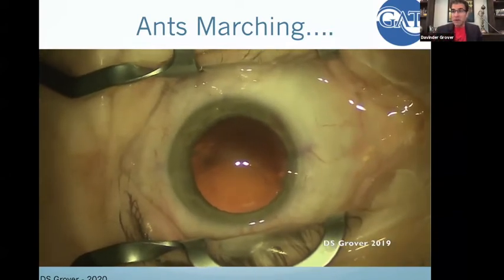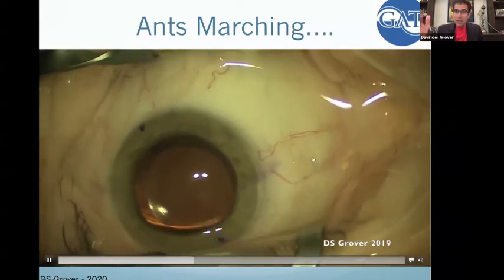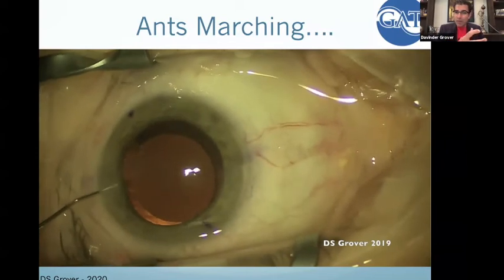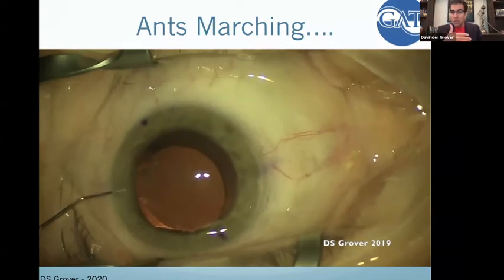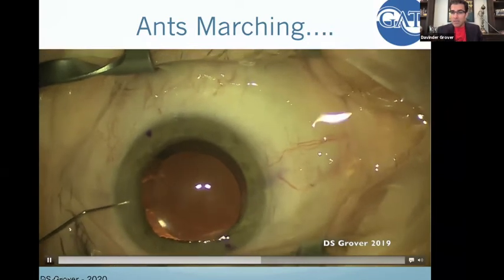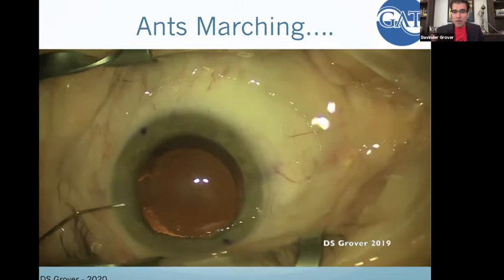Really just a kind of a fun video. Now I put the lens in the eye, and you can see if the pressure in the eye is lower, you can see fluid coming out. I'm going to pump up the eye, and I can reverse the flow the opposite way. And you see these clumps of blood going the opposite way. So that's an aqueous vein. This is really the best way in vivo to evaluate a patient's collector.